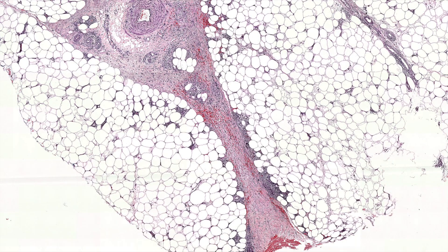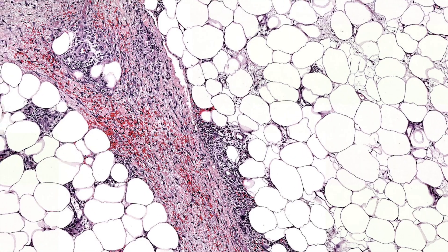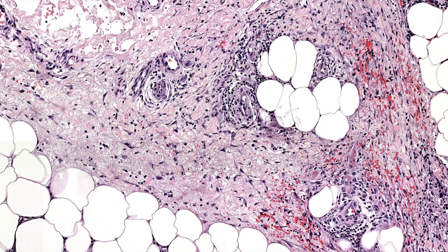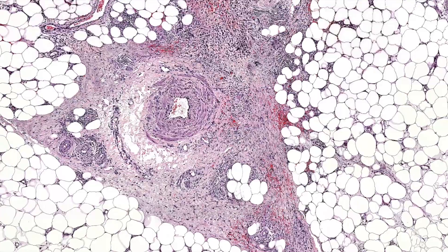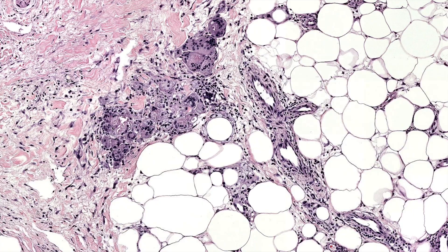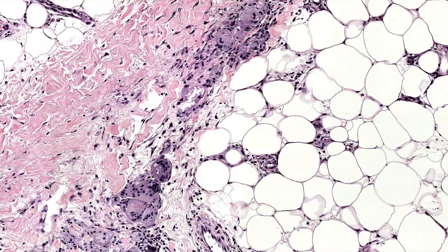In the earlier stage, you have a lot more inflammation — lymphocytes, maybe plasma cells, eosinophils, sometimes even neutrophils. There can be cases with a decent number of neutrophils where you think about infection. You often get a lot of hemorrhage, then granulation tissue with juicy myofibroblasts — stellate, almost nodular fasciitis-like areas with myxoid change. Then you may begin to see granulomas with giant cells. These granulomas sometimes have a spiky radial arrangement called Miescher's radial granuloma.